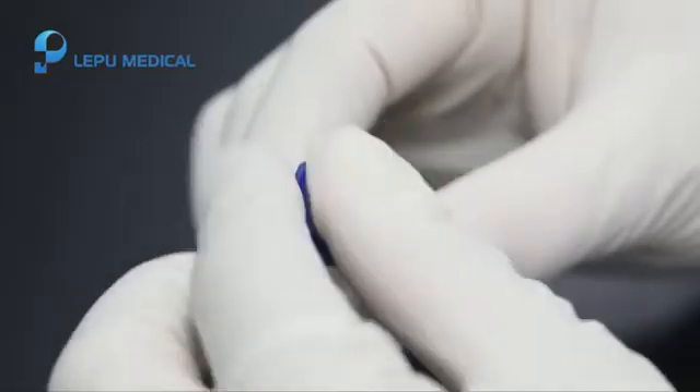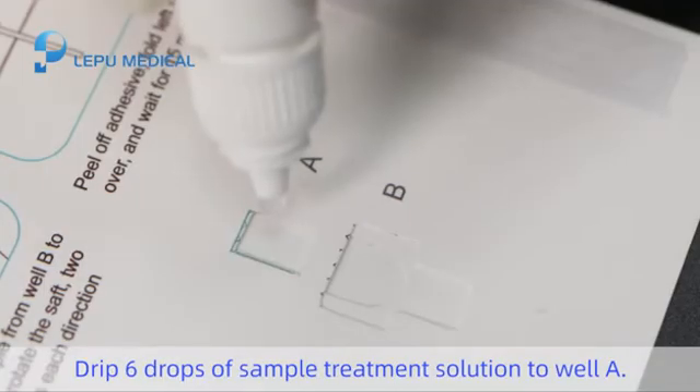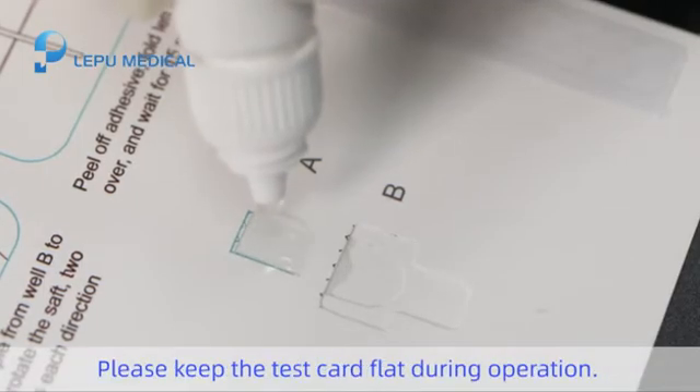Step 3. Drip 6 drops of sample treatment solution into well A. Please keep the test card flat during operation.